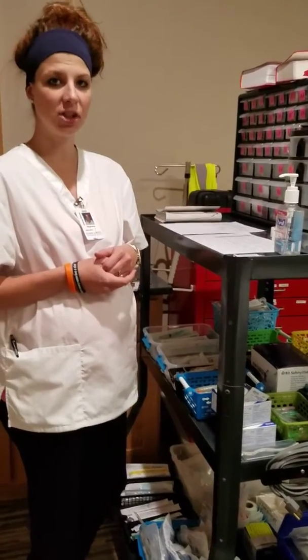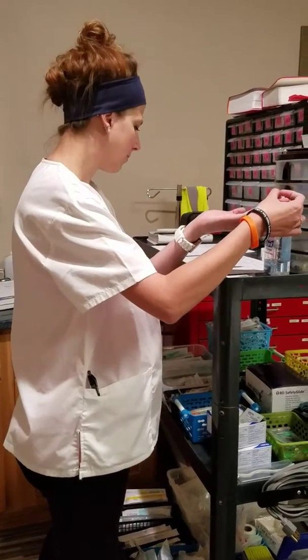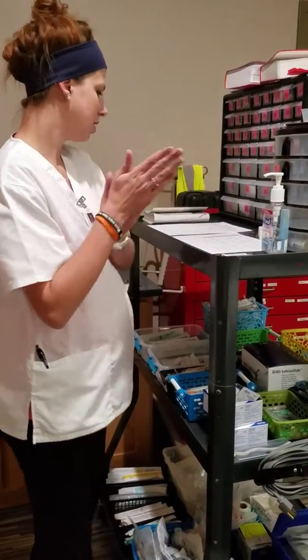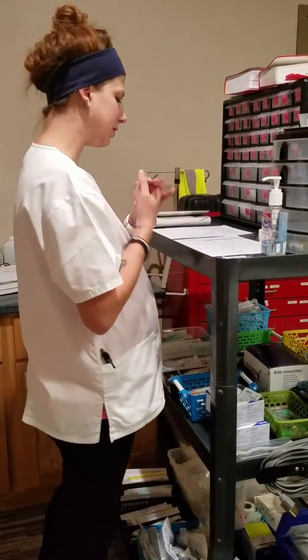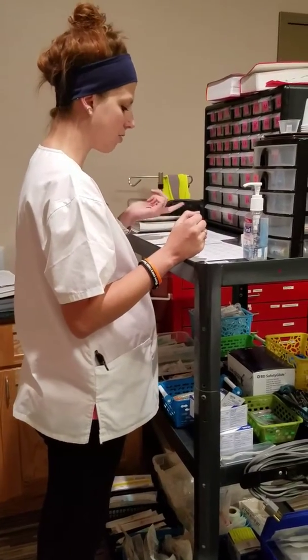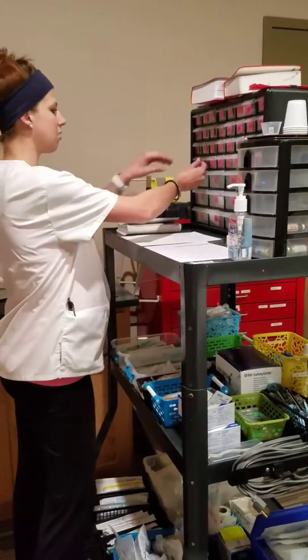I'm going to be doing my intramuscular injection. We are going to be doing Vistaril, so I'm going to perform hand hygiene. I'm going to come to my Pyxis. Vistaril is on here. It's also known as Hydroxyzine, and they have that in D3 right here.